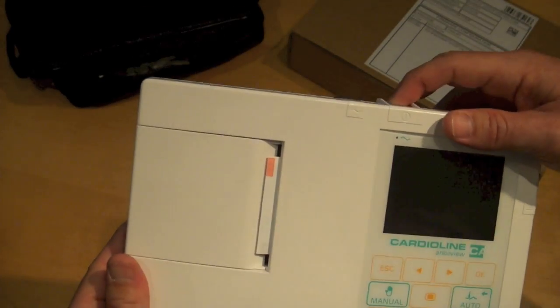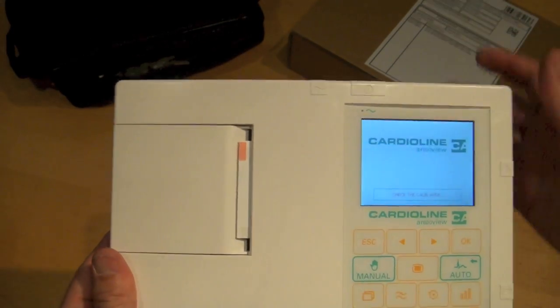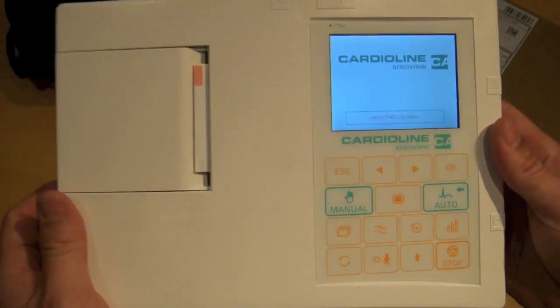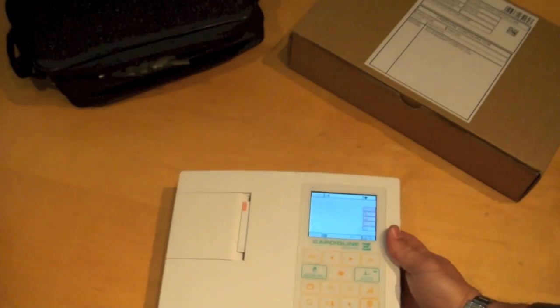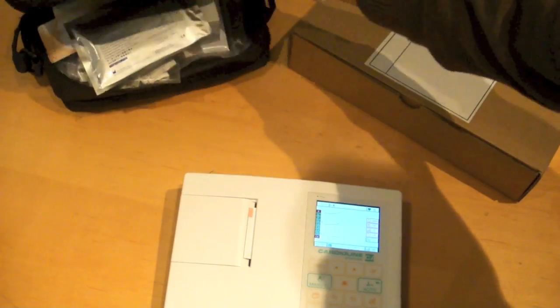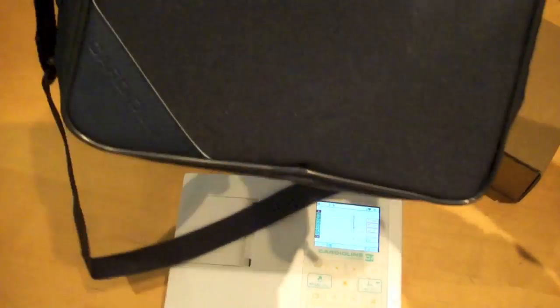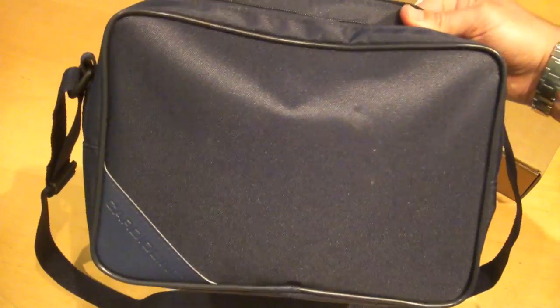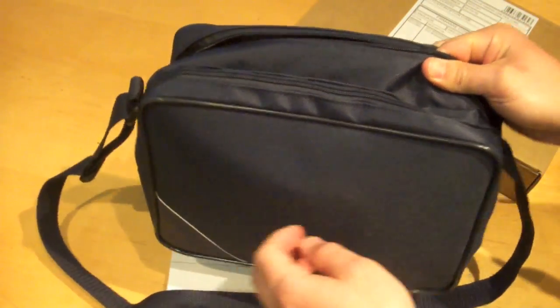I'll go ahead and turn the machine on here. And while we're doing that, while the machine is loading, I'll show you the standard accessories. It does come with this very nice carry bag that's custom sized for the machine itself.